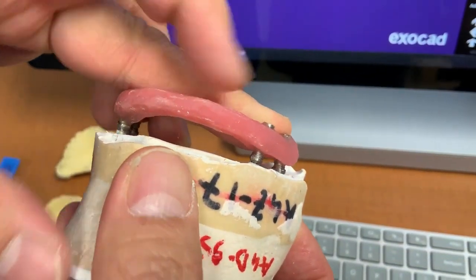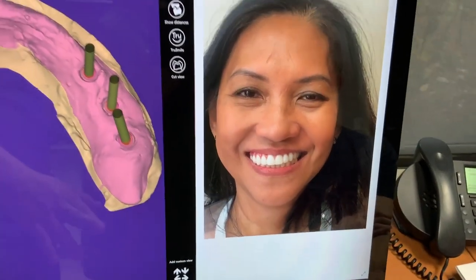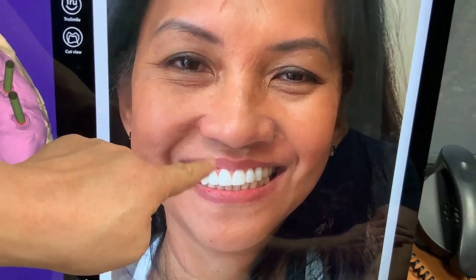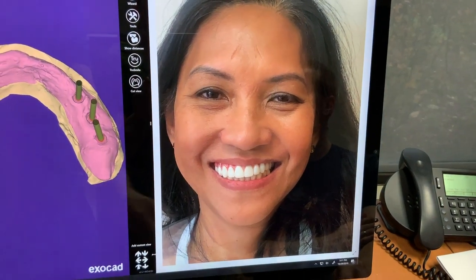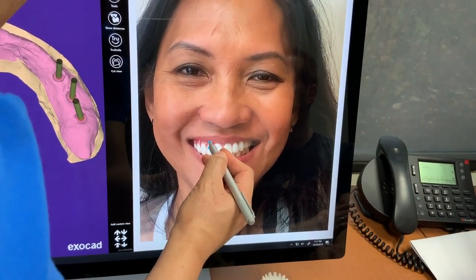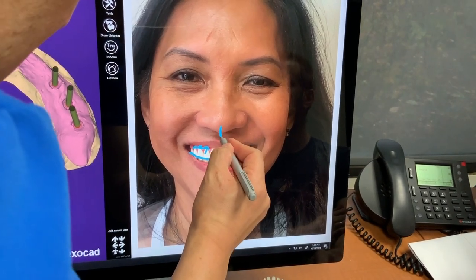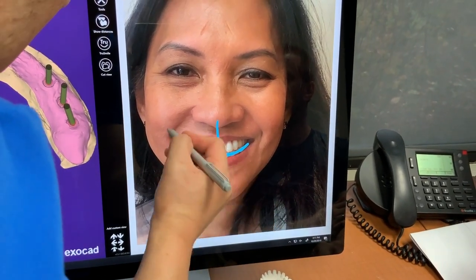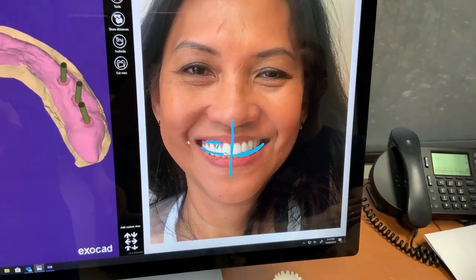After that we made a bite block and wax try-in. Dr. Zebra and I discussed the lip position — one side is higher than the other. So what we're going to do is make this side a little bit higher. The gum isn't showing as much on this side; this bigger smile is the maximum smile. We add a little bit more here, cut this area, make it longer, and cut the other side to get the same line — making a better smile selection, a little bit longer and a little bit more contoured.